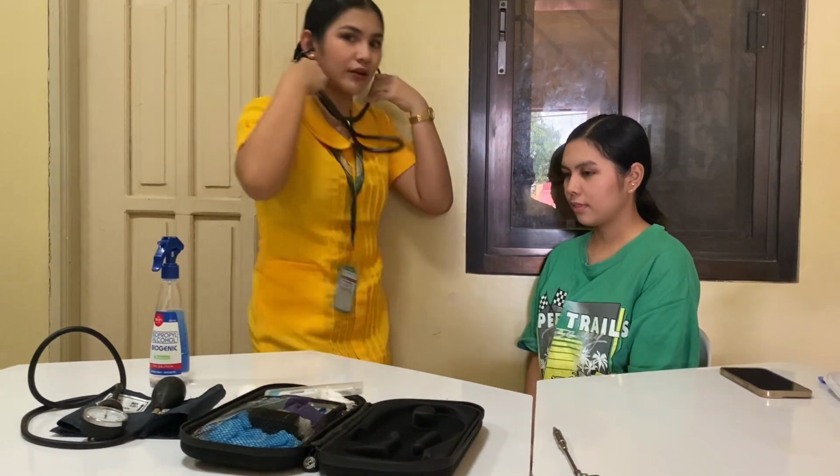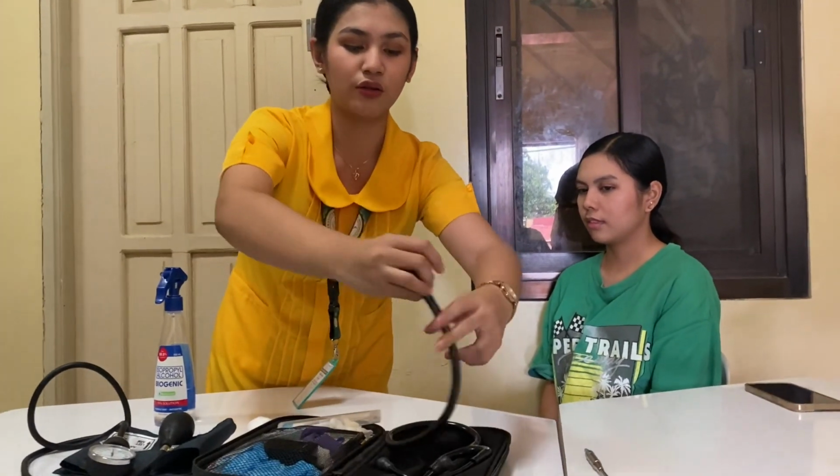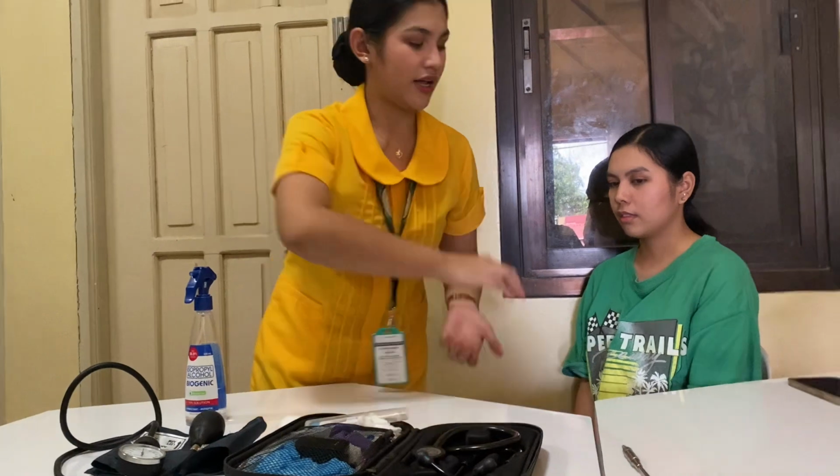The client's apical pulse is 72, which is just within the normal range. And I located the apical pulse at the left midclavicular line, fifth intercostal space.